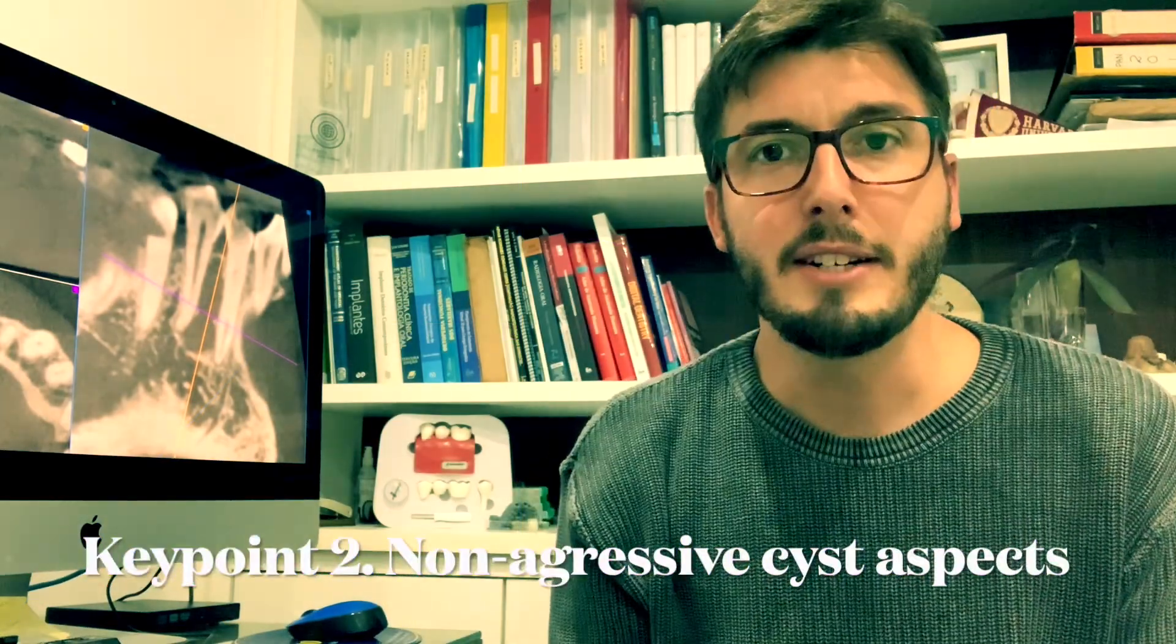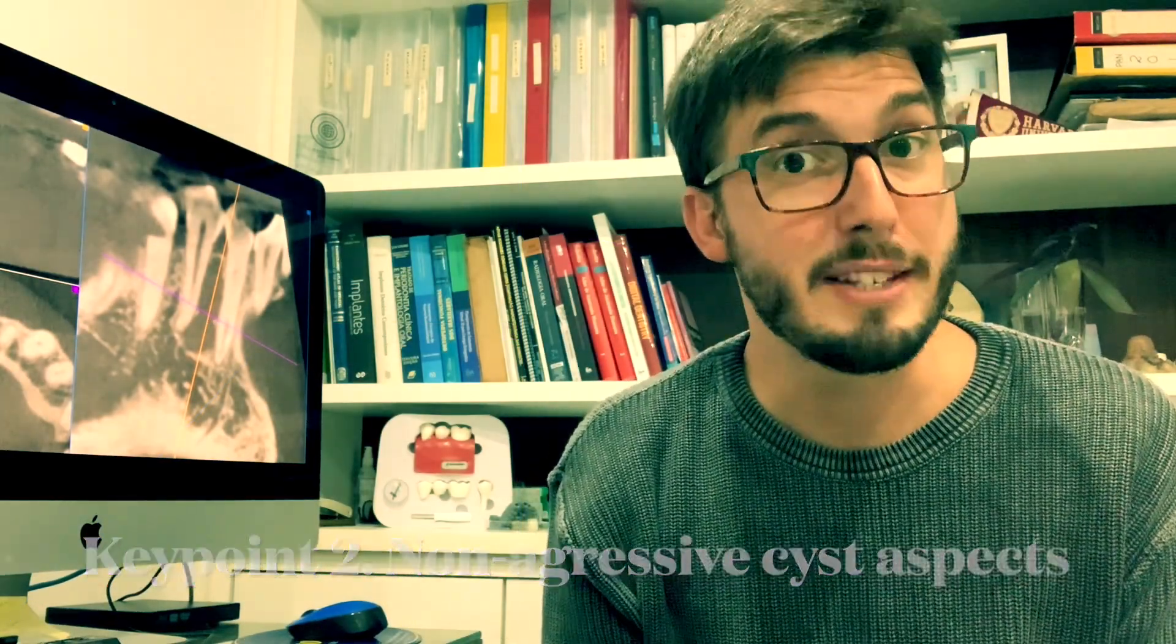The second key point is that we have the cyst aspects. And it turns out that the cyst is not so aggressive. So we have a well-limited radiolucent or hypodense if we are talking about CBCT lesion which usually extends from the alveolar crest downwards to the periapical area between the two teeth involved.